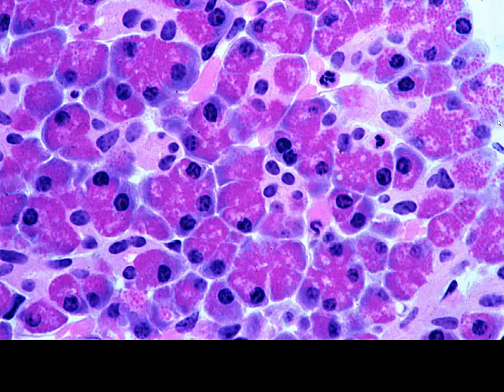Once again, very high magnification of the exocrine portion, looking at our parenchyma. We're going to have the acinar cells that are present here. But also remember, in the pancreas, we also have centroacinar cells, these lighter cells that we're going to find lining and being present in the center of these acini. And so that's largely what we're seeing here.